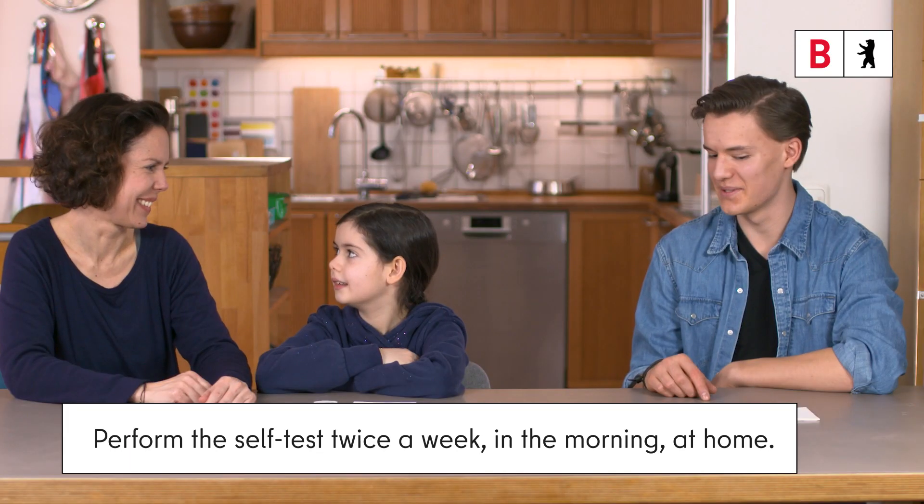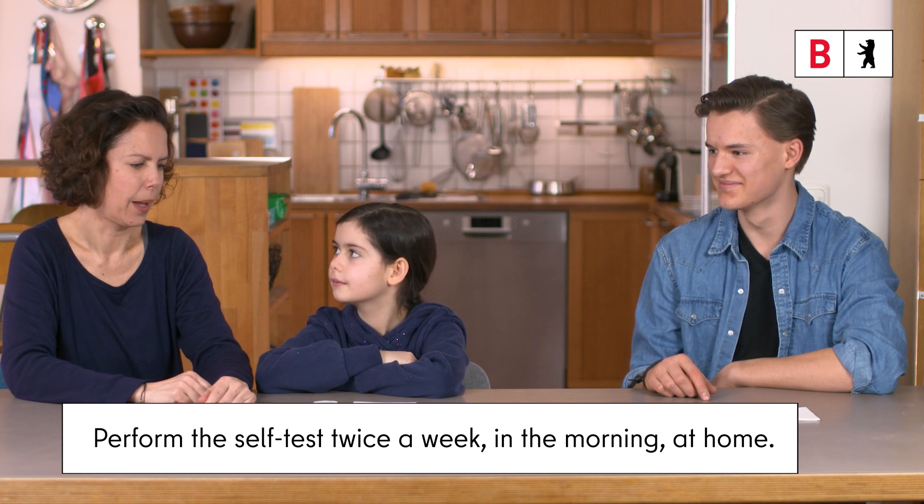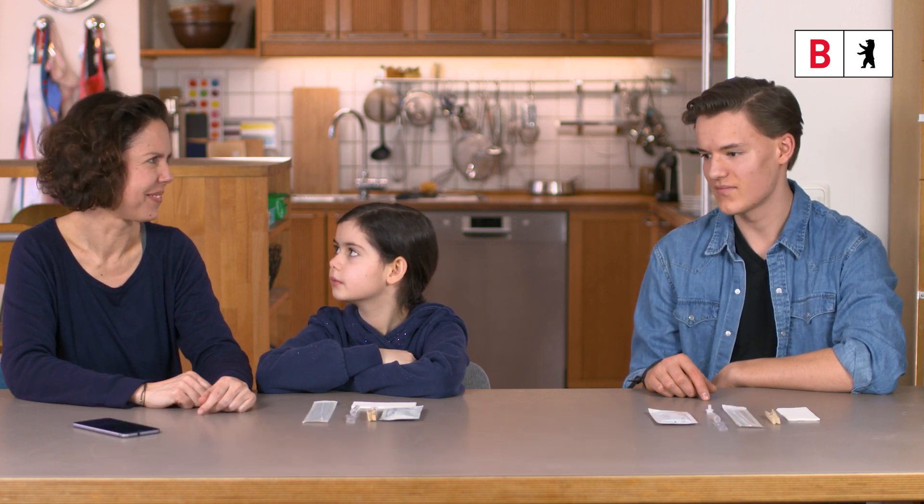You should perform the self-test twice a week, in the morning, at home. The test materials should be at room temperature, between 15 and 30 degrees Celsius.